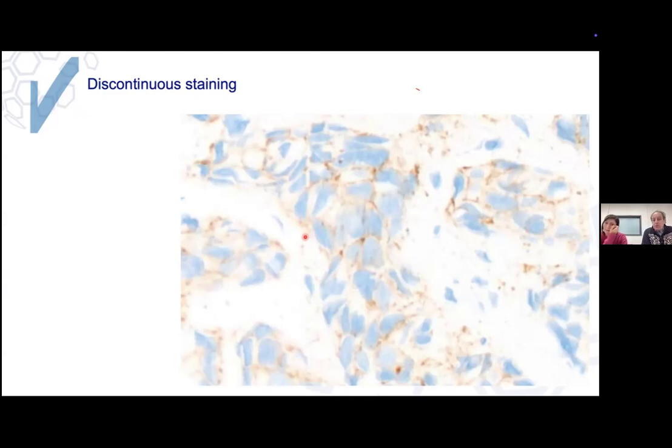And that's interesting. Simona is now telling us that sometimes the scoring pattern is 1+, but still you don't need to call it 2+ to reflex it. You can call it 1+ IHC. However, I have some reservations regarding the pre-analytics, so I'm calling it indeterminate, and I want ISH.